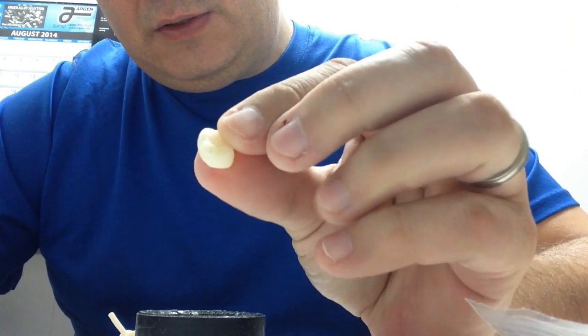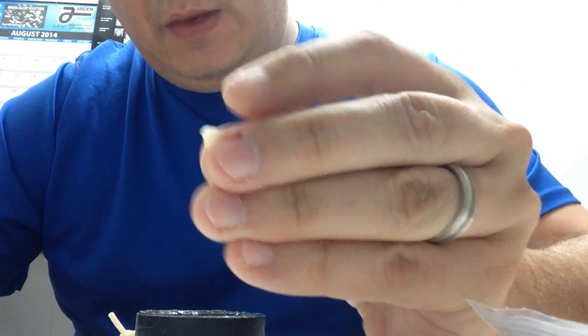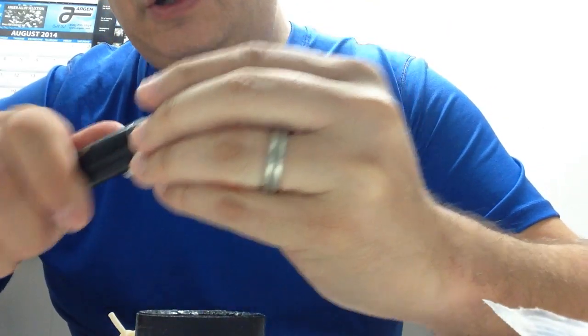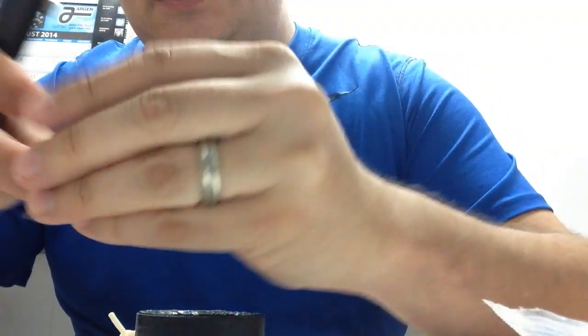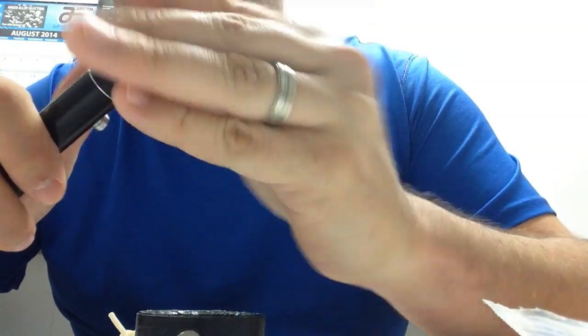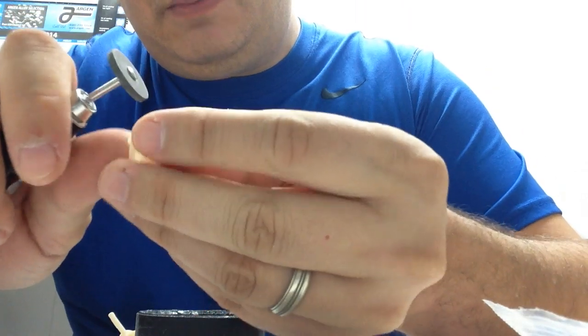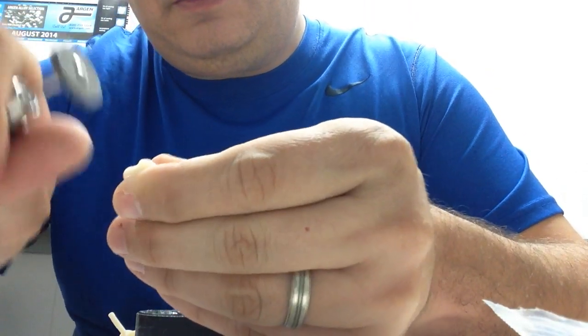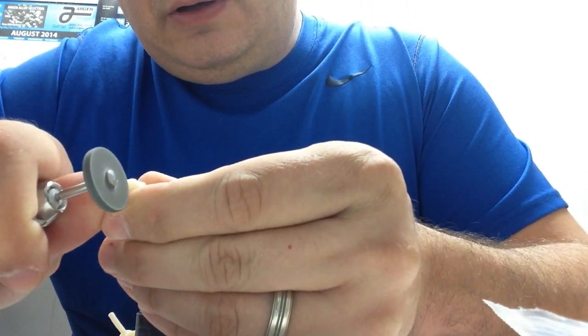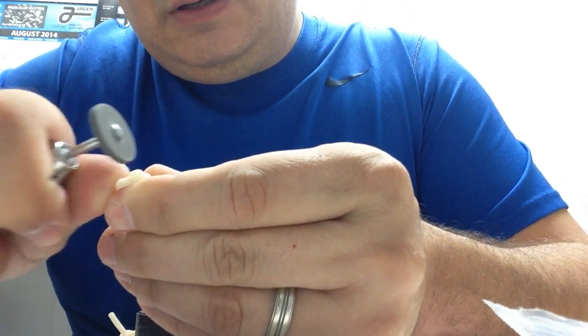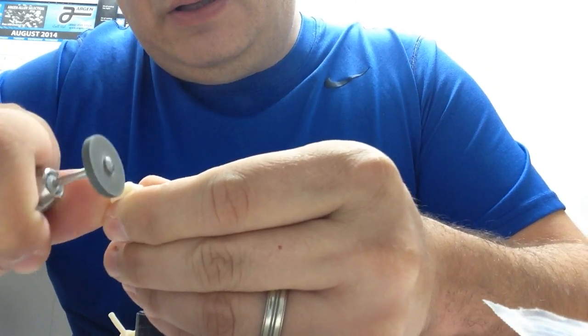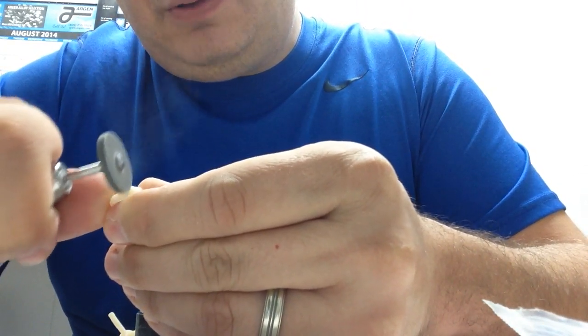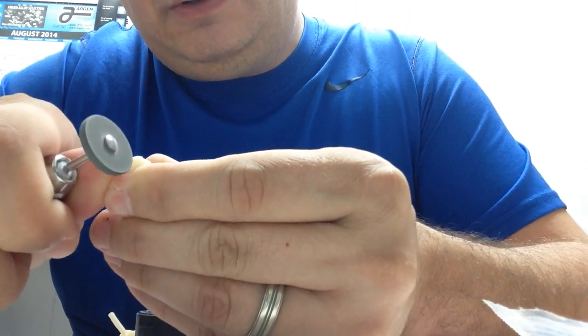So here we cut the sprue. We still have a piece of sprue attached to the crown, so this is where this NTI will come in handy. Same idea. I cover margins with my finger. And I am going one direction little by little and give it a split second to cool down.